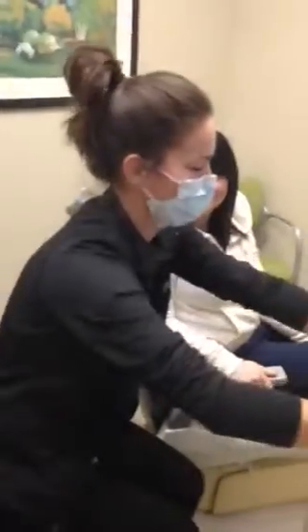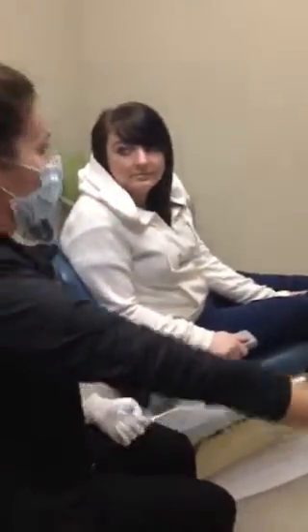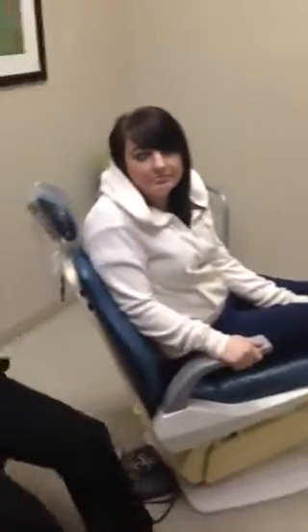It's kind of just like a great big loud noisy digital camera. This is the lens here. This part's going to be going in your mouth. That's kind of what I see on the screen. And then every time I take a picture, I'm going to rest this on each tooth. It'll beep, and it's just piecing together all those tiny little pictures to make one big 3D picture.